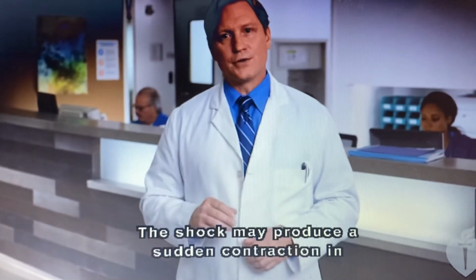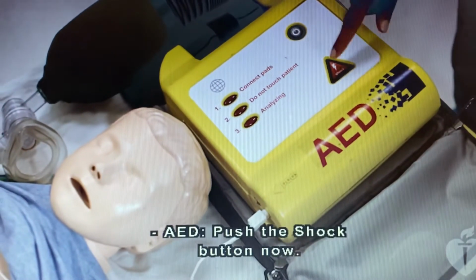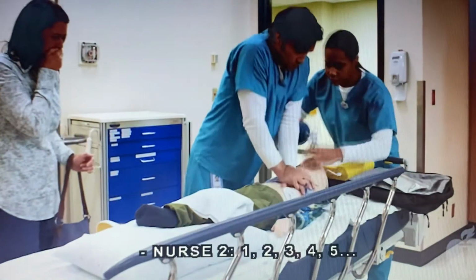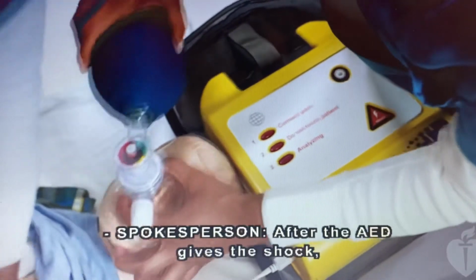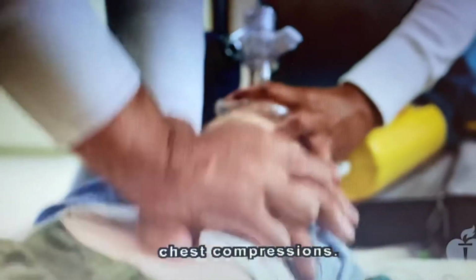The shock may produce a sudden contraction in the victim's muscles. Push the shock button now. Shock delivered. Resume chest compressions. 1, 2, 3, 4, 5. After the AED gives the shock, resume CPR immediately, beginning with chest compressions.